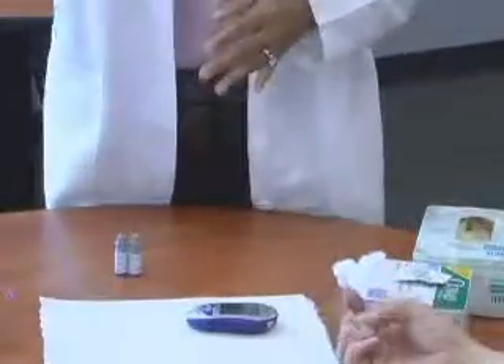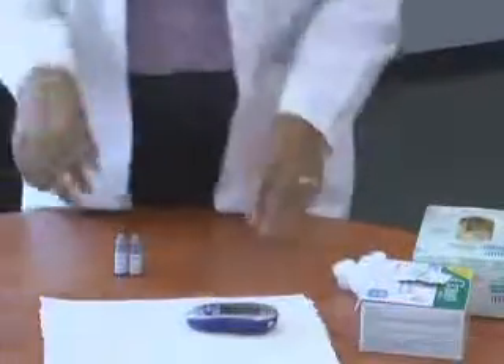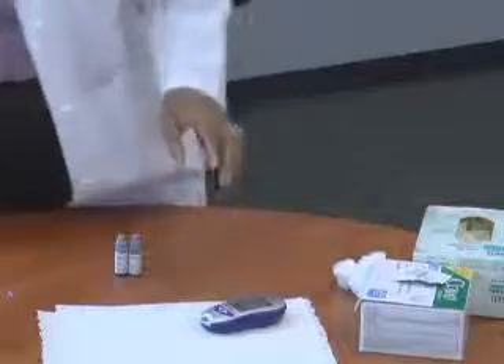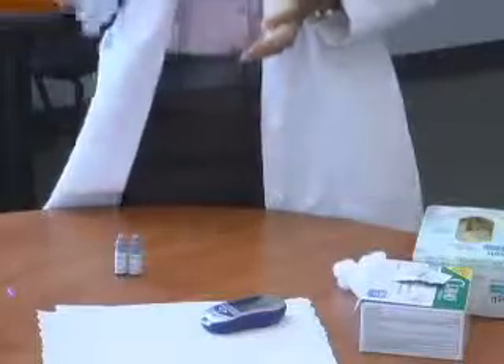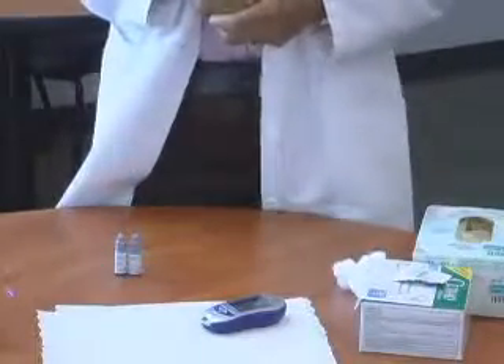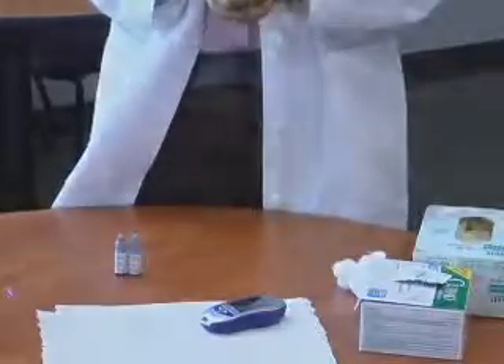Take the strip out with your gloves on and throw everything into the trash can. The patient can throw away the alcohol swab into the trash can as well. Then you are ready to write his blood glucose value on the results form and give it to him and explain it to him.